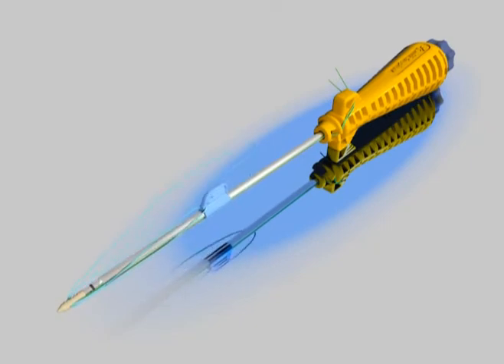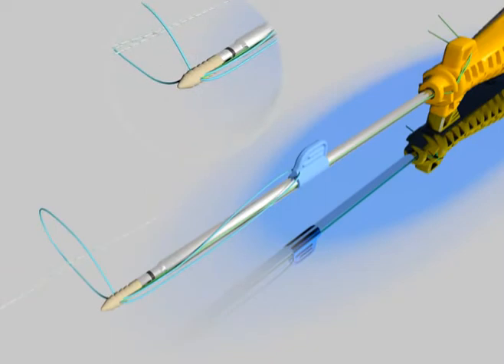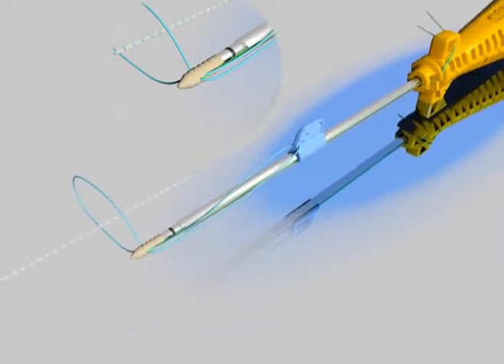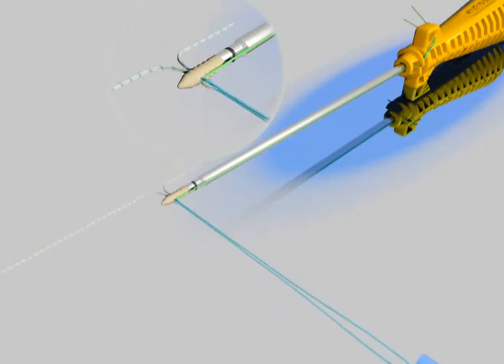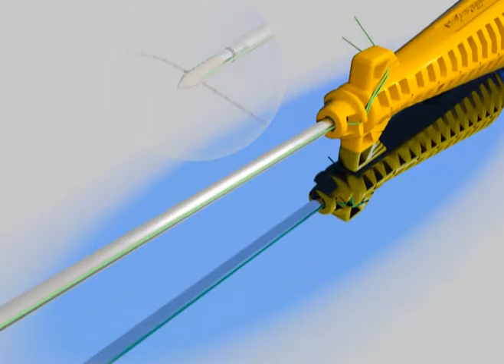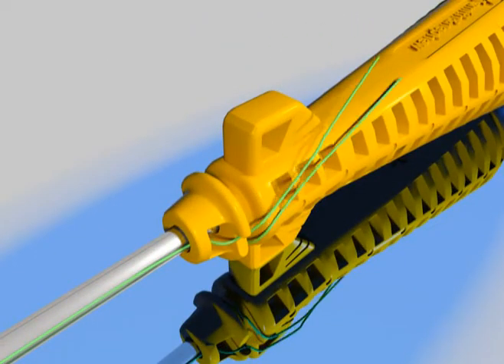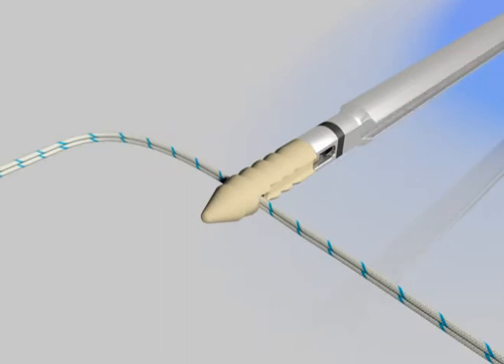The technique begins with passing a strand of ultra braid suture through the labrum. The drill guide is then introduced and a hole is drilled on the rim of the glenoid. Both suture limbs are then passed through the threader loop and brought through the suture eyelet. The anchor is tapped in and the retention suture is removed.